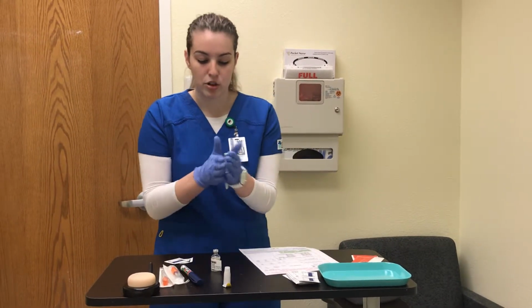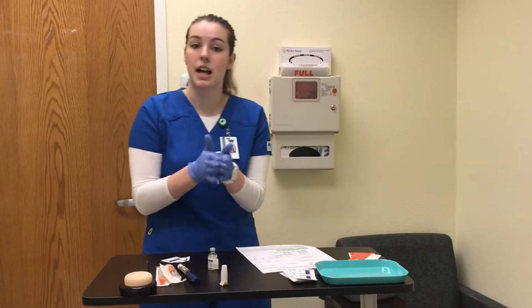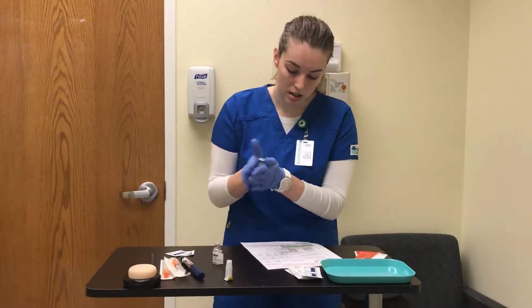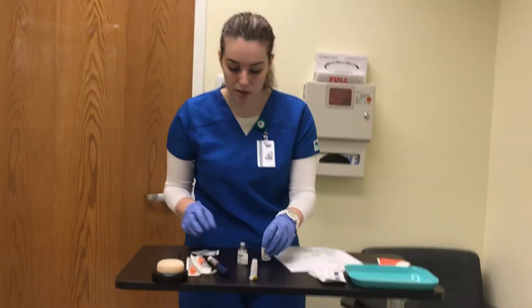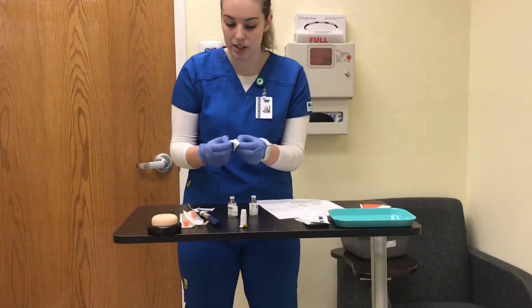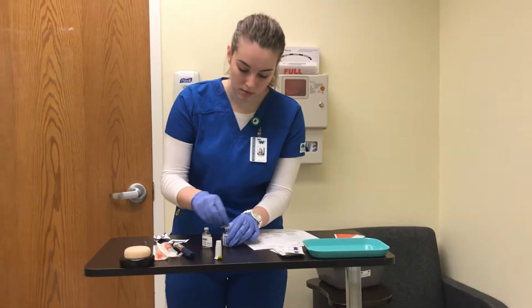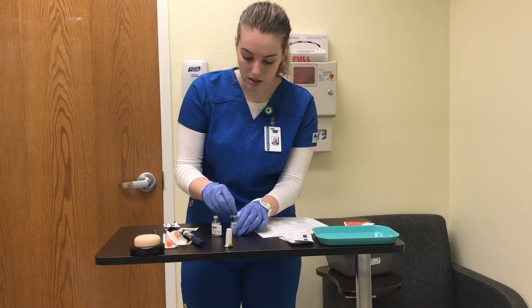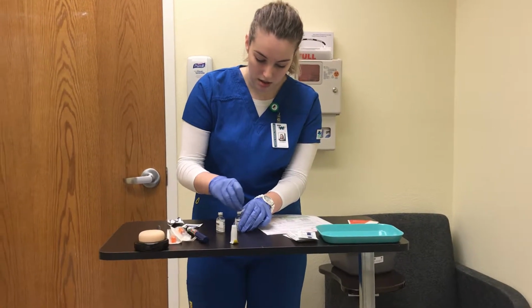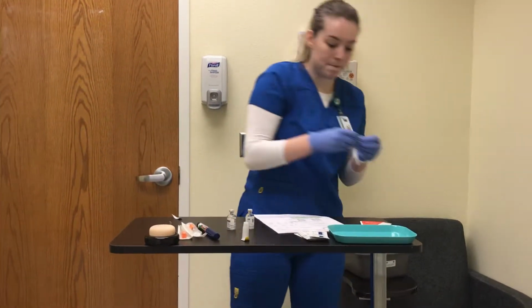Before we do so, I'm just going to mix the NPH, as it is a cloudy insulin, and sometimes it can settle. Okay, so that's all mixed now. And then I will clean the tops of both of my insulin vials for about 5 to 15 seconds. Okay, and then I can do my second one.